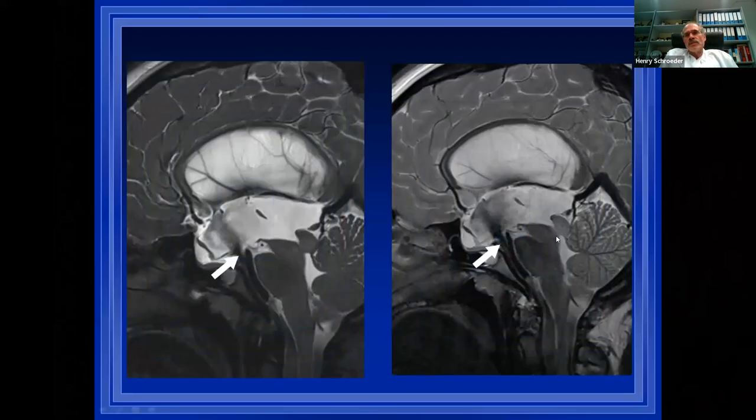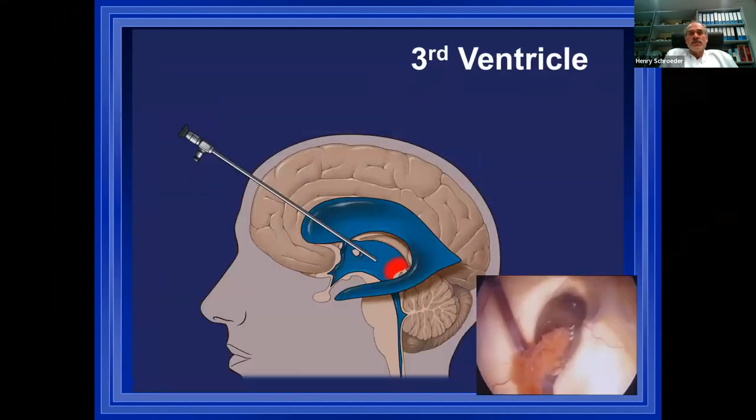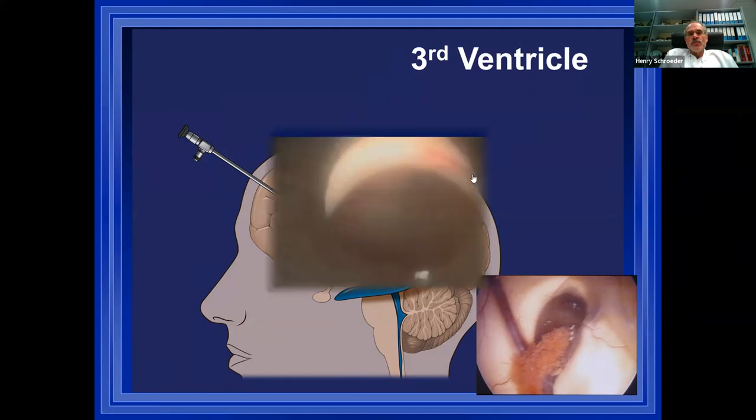We don't take a biopsy if you see a tectal glioma non-enhancing, because we know of the benign nature of these tumors. And I follow many patients more than 15 years, no growth at all in these tumors sometimes. If you have small ventricle, if you have a small foramen of Monroe, of course, when you have a tumor here, you cannot make an ETV and a biopsy from the same borehole. Then you need two boreholes, or you need a flexible scope. If you have a small foramen, then you cannot tilt it. Sometimes we have very small ventricles.